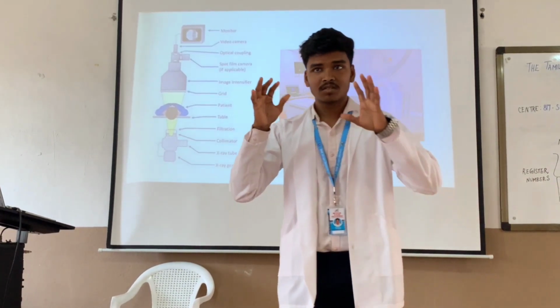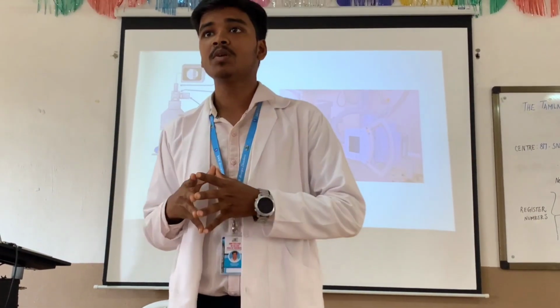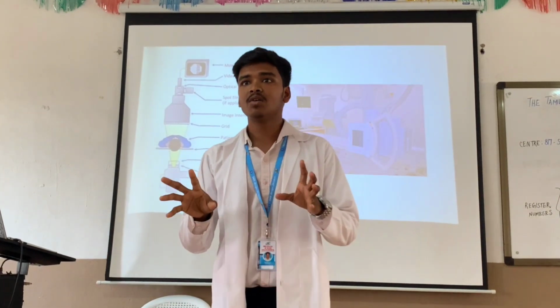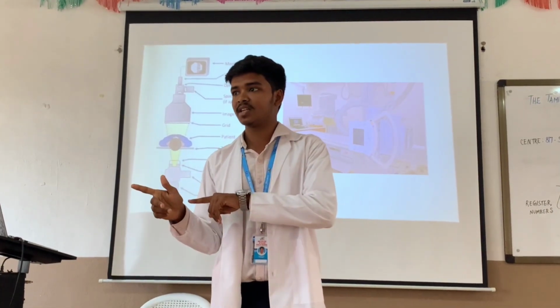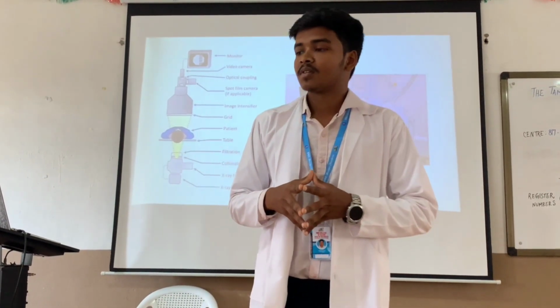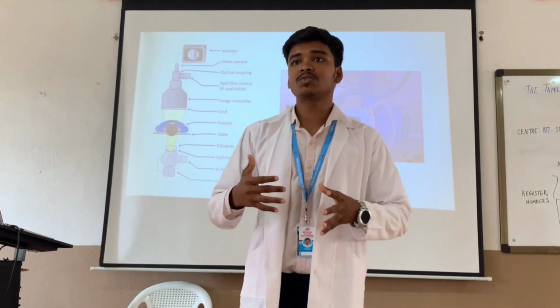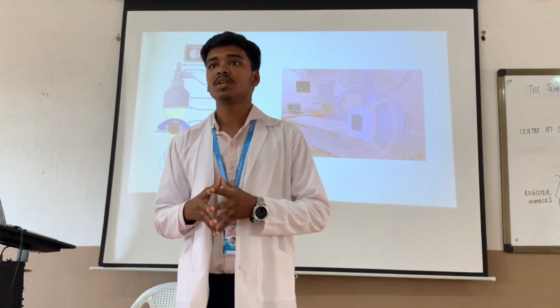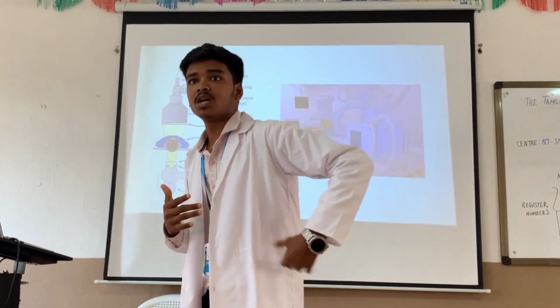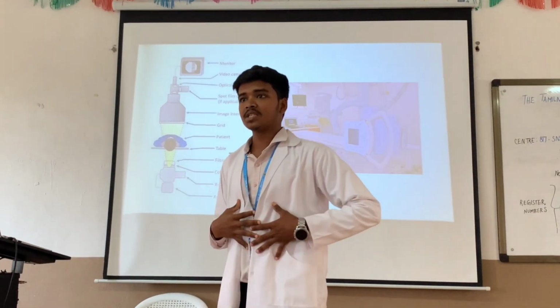The X-rays from the generator and the X-ray tube contain both low energy and high energy X-rays. The low energy X-rays cannot pass through the patient; they are absorbed in the patient's body.